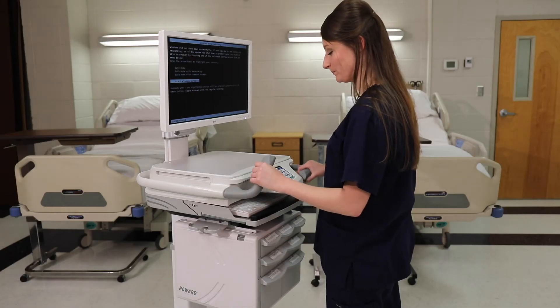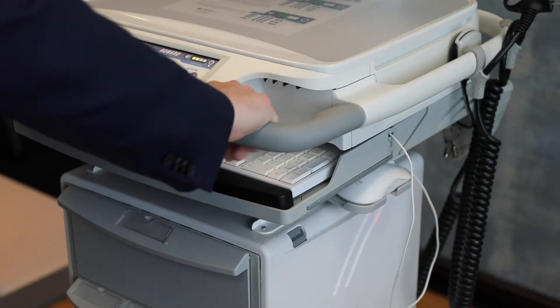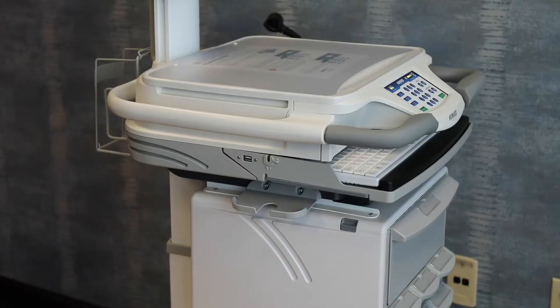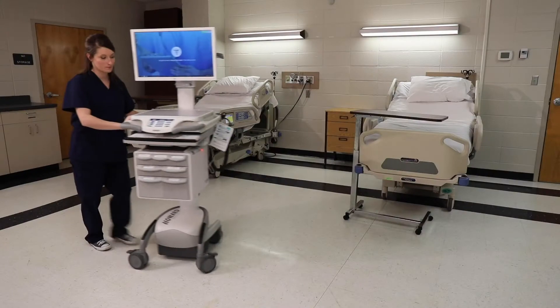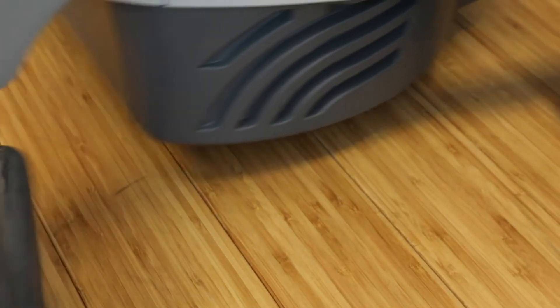On the front of the cart are two gray ergonomic handles. These handles are adjustable to the most comfortable position for easy control of your cart while in motion. The 270-degree wraparound handle allows the user to maintain control of the cart from any angle. To move the cart, lift the locking lever on each of the two front casters so that the cart now rolls freely.